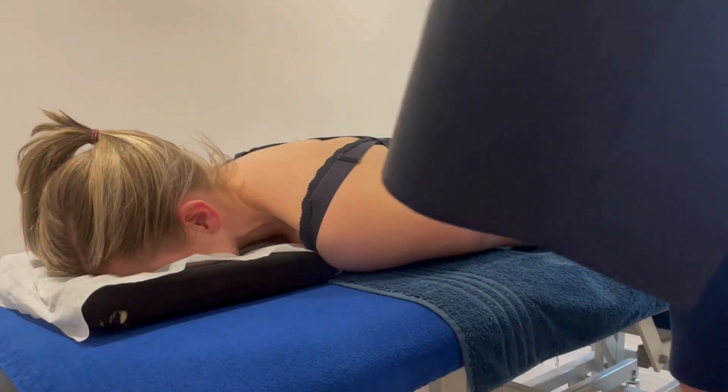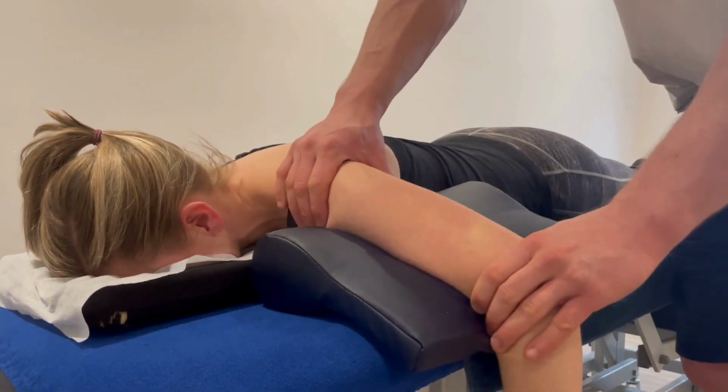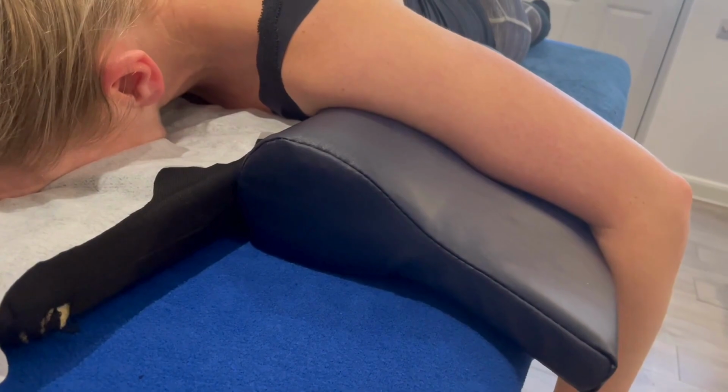An alternative use for these pillows is to place them underneath the arms in the prone position. So I might use this for somebody with shoulder pain, mid-back thoracic pain, or just to generally address poor posture with hyperkyphosis of the thoracic spine. You may use this for the target arm, or we can use it for both sides. Just check that the client's comfortable and that they're happy in this position.